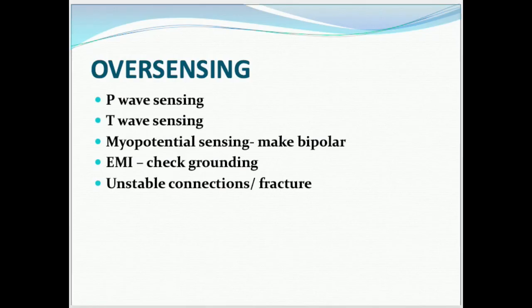During myopotential oversensing, change the pacing configuration to bipolar. In case of electromagnetic interference, the grounding of the equipment must be checked. During unstable connections, a fracture can also lead to oversensing of either extracardiac or intracardiac signals.